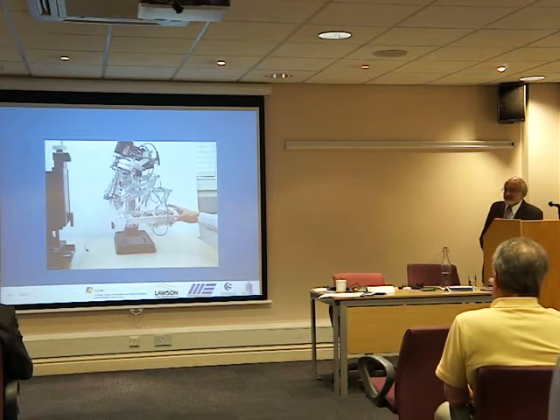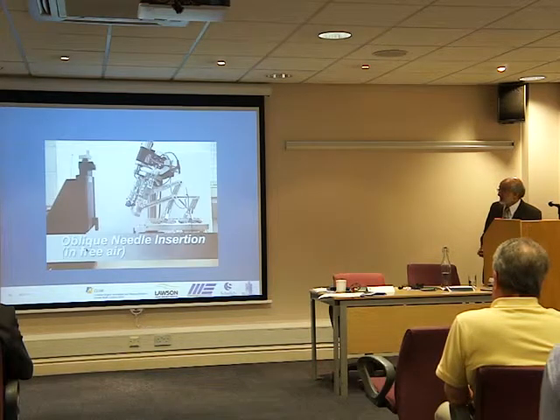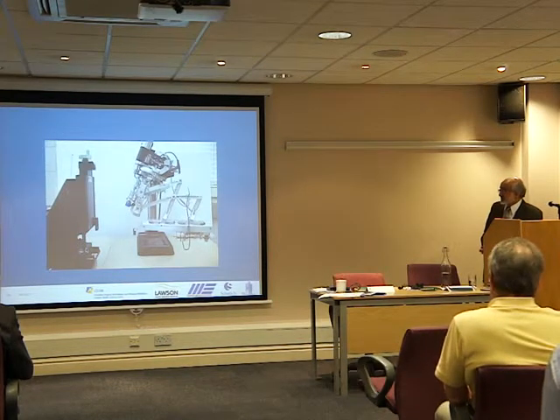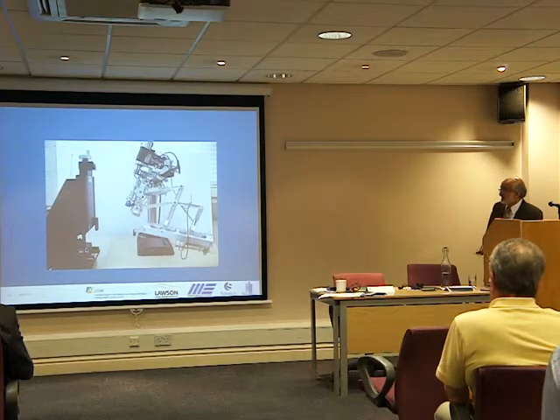It's also fully back drivable, so we can pull the needle out in case the clinician wants to take over. So this is an illustration of the motion of the device for oblique needle insertion. So the needles don't have to go in parallel trajectories.